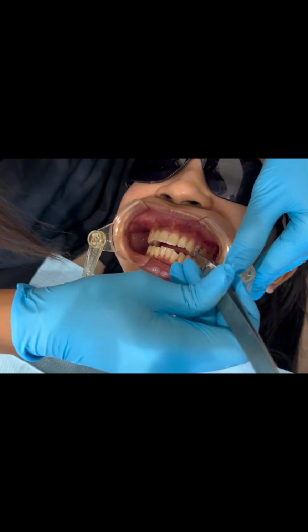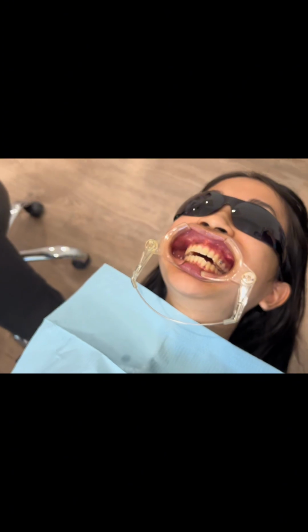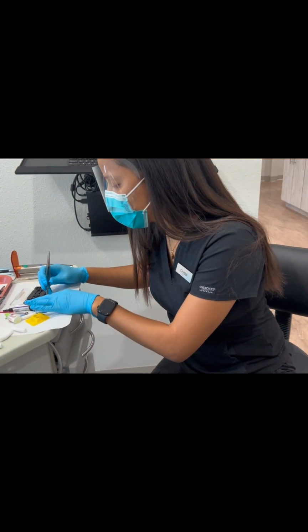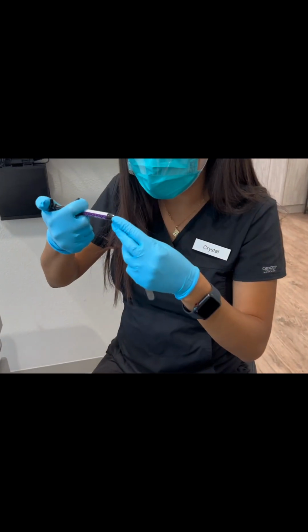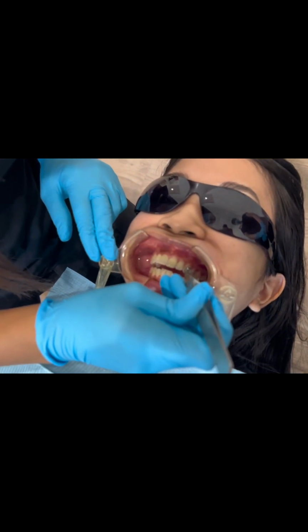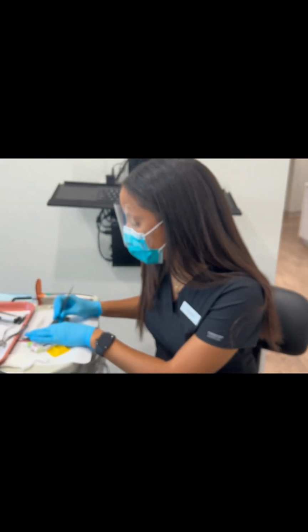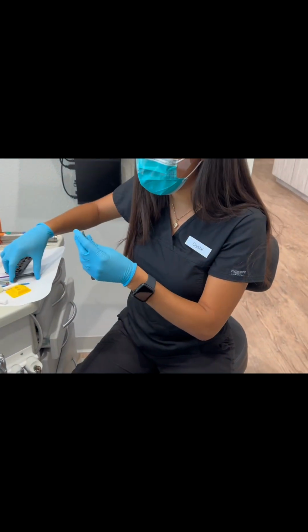And then you're gonna go ahead and put it on the tooth. You see that? Always start from the back first. So if you're doing 6 to 6 or molar to molar of prep for the doctor, then you're going to start with the 6s on both sides, okay? But just to show you how I do it, I'm gonna do the back ones on this case first.